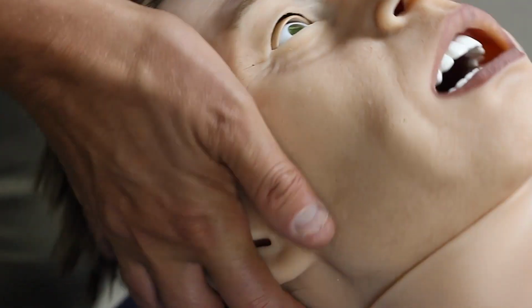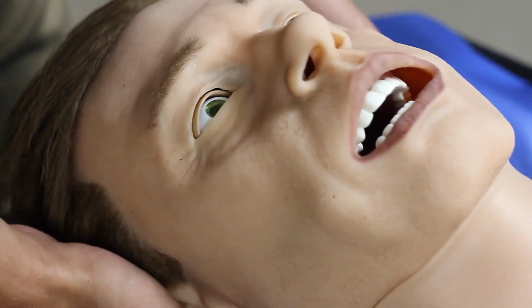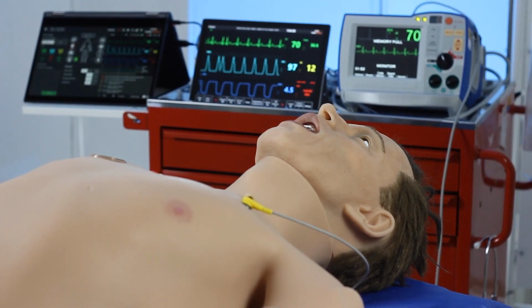and we can do head tilt chin lift. And his head moves in a whole range of motions, and it's heavy, realistic of an adult. The simulator can be used as both a male and a female, so it has interchangeable genitalia. This obviously allows us to replicate both male and female conditions, which is important for student experiences.